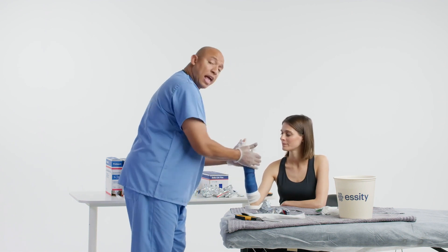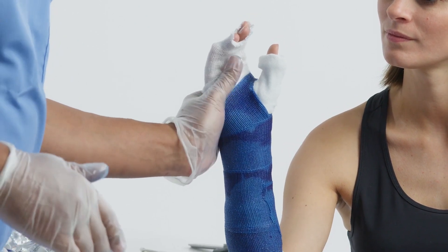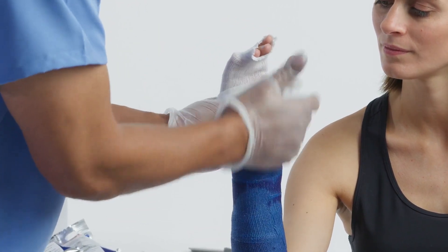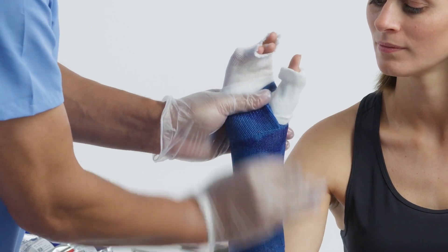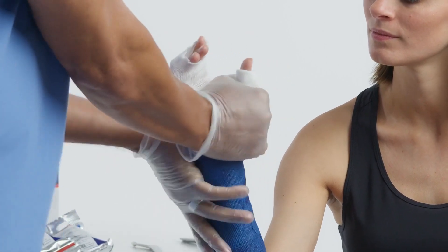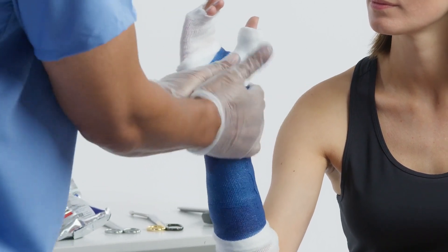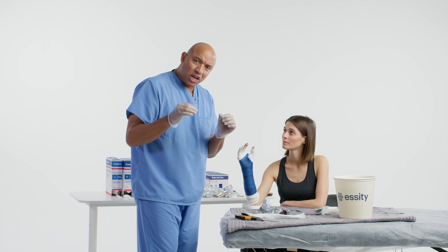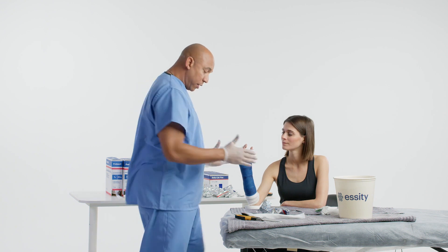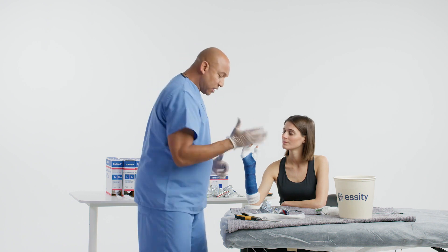When you start to laminate, you want to support the extremity because, number one, they're in a lot of pain. Start to laminate gently. Then switch hands to laminate the dorsal aspect and more of the ulnar aspect also. Once it starts feeling like pitting edema, or you can feel the cast tape start to feel a little bit harder, you want to start concentrating on your mold — the interosseous mold in particular.